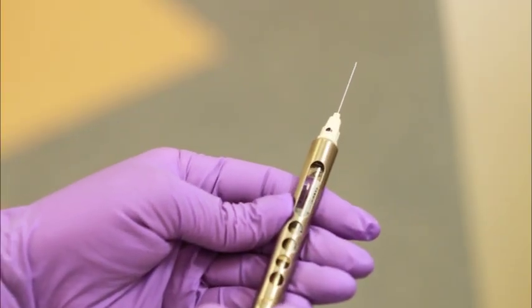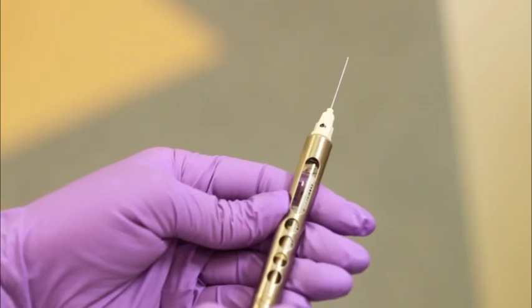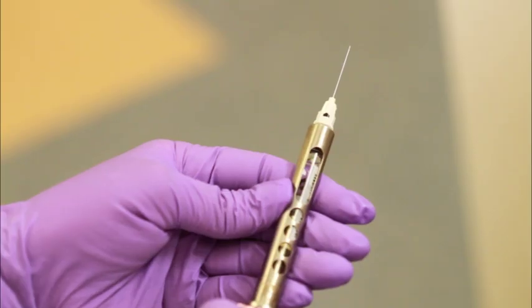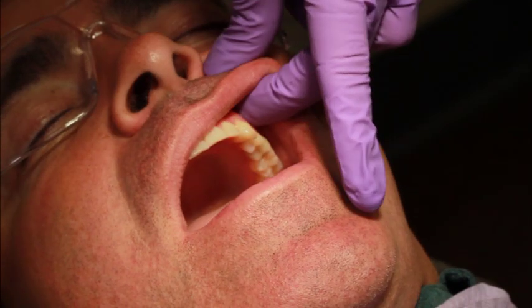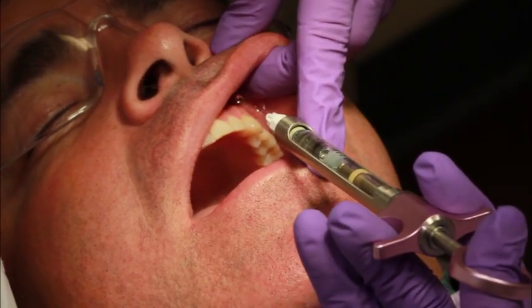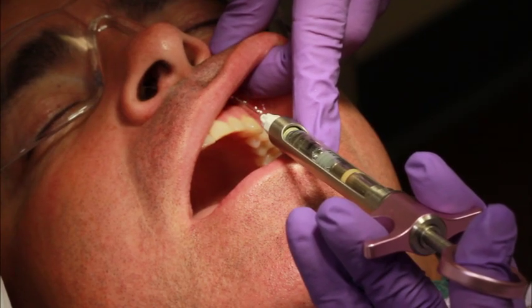Using a 27-gauge short needle in the syringe in the dominant hand, orient the bevel of the needle away from the large window of the syringe to ensure bevel orientation toward the bone. Establish a fulcrum that allows you the greatest stability of the syringe. Place the syringe parallel with the long axis of the tooth, with the large window facing you.